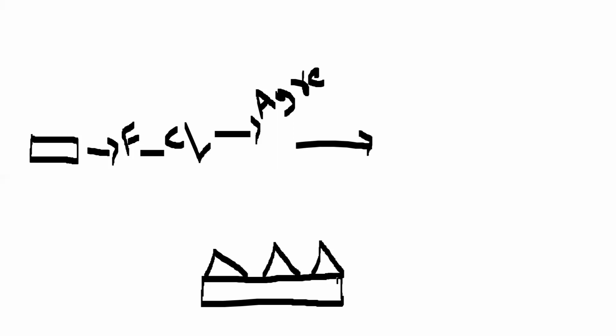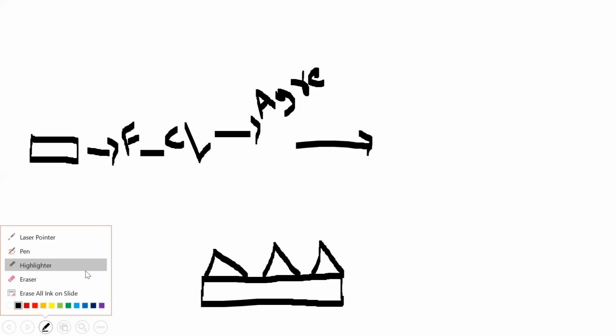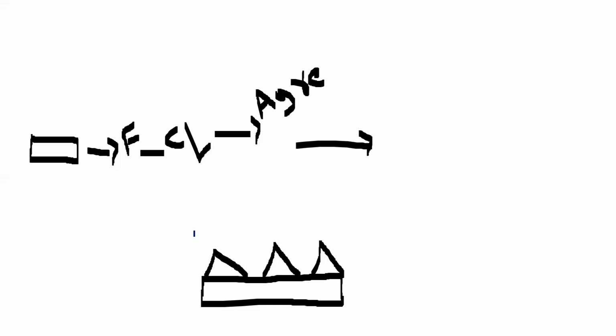Now to this tissue, I will tell you the traditional approach, then I will tell the problems. Wait, let me take another color. To this tissue, my idea is to bind the specific antigen with the help of a specific antibody. If it is the CD4 antigen in the white blood cell, I will target this CD4 antigen with the help of an anti-CD4 antibody. With the help of the anti-CD4 antibody, I am able to bind.